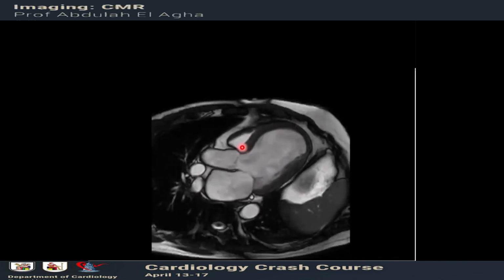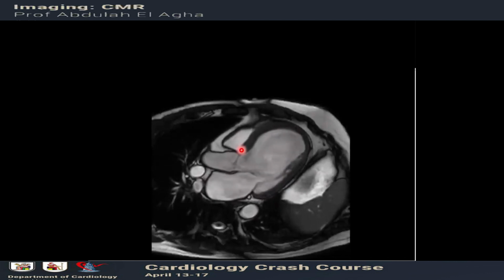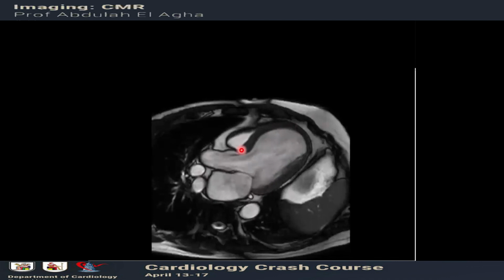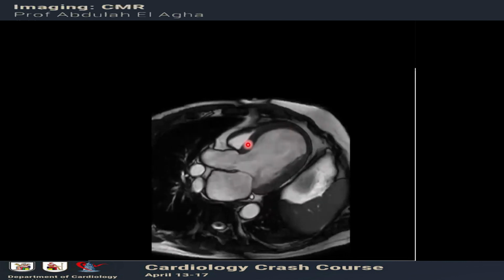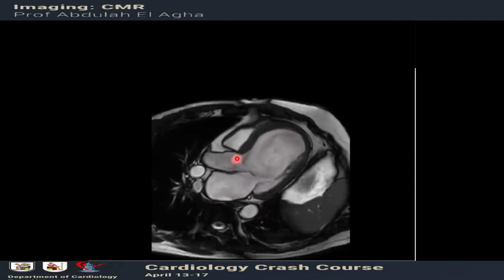But when we say akinesia, even in echocardiography, you have to comment not only on the motion or the thickening of the segment. You have to comment on whether the segment has preserved thickness or is thinned out. Is it preserved thickness or thinned out here? Preserved. And at the same time, it's totally akinetic. So this is really, in echo, it's like this.